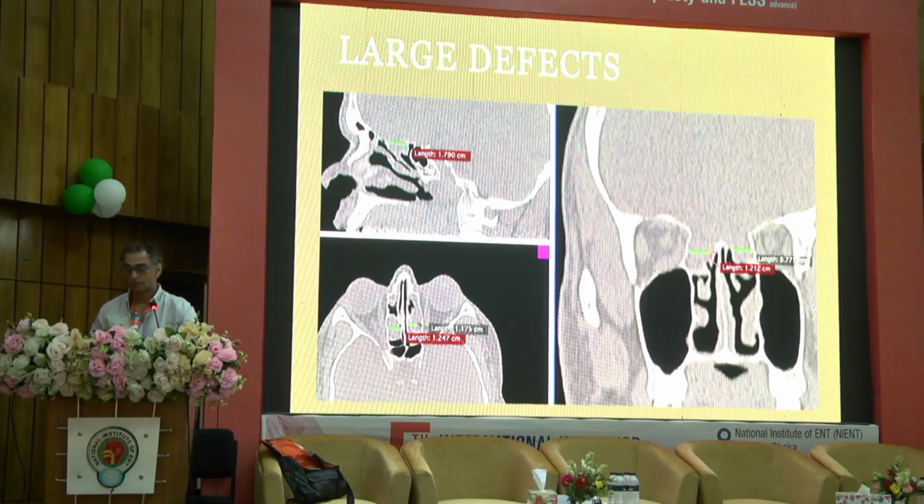Boss, this cannot be done endoscopic. There's a septal perforation to add to it, so I don't have any hard flaps. You have to go transcranial. And he was accompanied by his ENT, and he said, we have been to 3 doctors, everybody tells us that. Patient refuses to go transcranial, you have to do it endoscopic. I said, it's not possible. He said, no, you try.